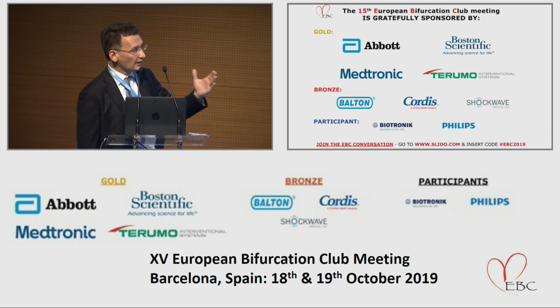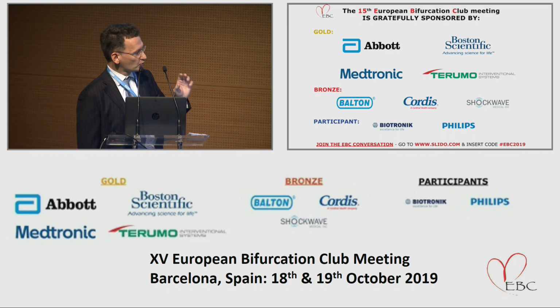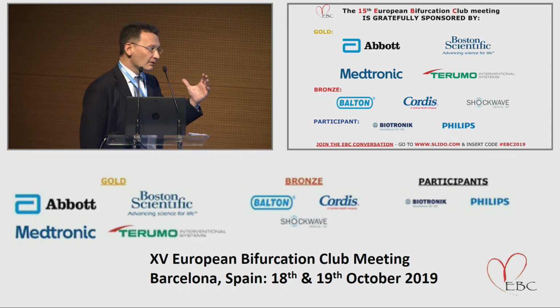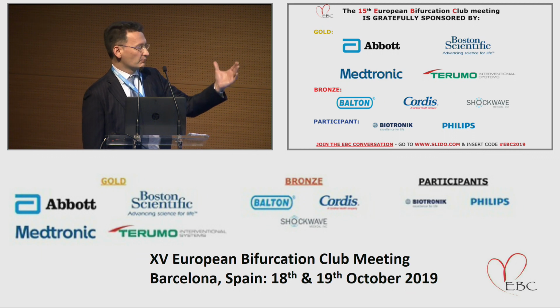So the first hallmark, I think, is easy to reach. The second mark is probably something that, at least in my opinion, we would have to combine with intravascular imaging in order to be able to deliver a result of undoubtedly long-term patency and good angiographic and clinical result.